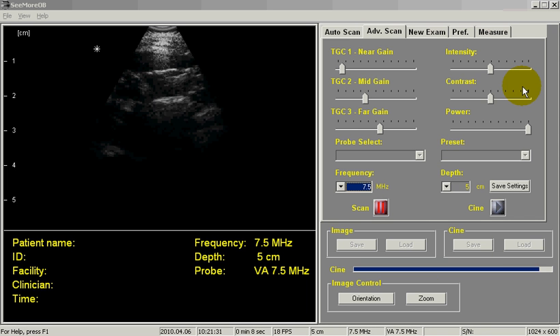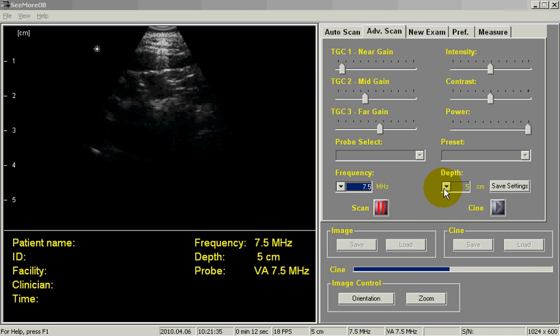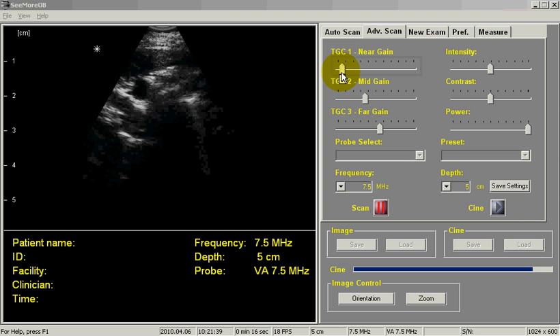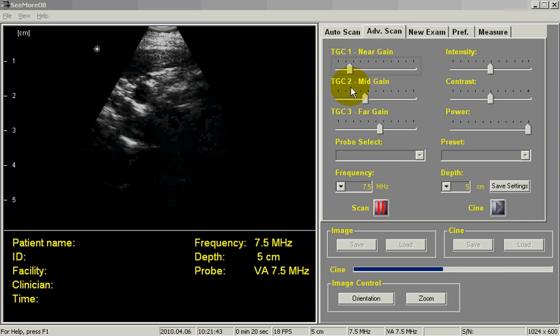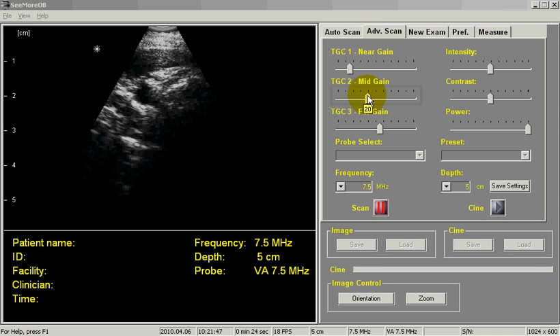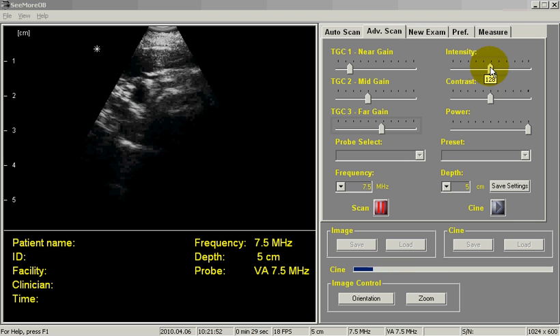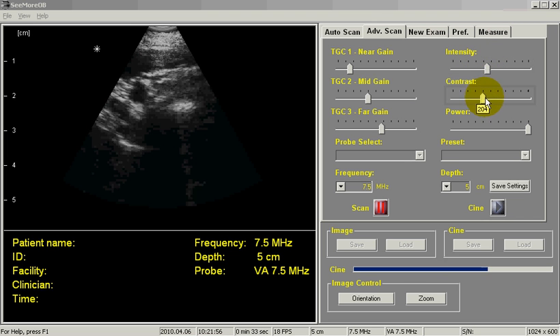Here I'm scanning at 7.5 MHz at a depth of 5 cm. I'll bring the near gain up just until I start to get a bloom in the near field, and then I can adjust my mid gain and my far gain to get the desired image. Intensity and contrast are pretty much your preference for how contrasty an image you prefer.